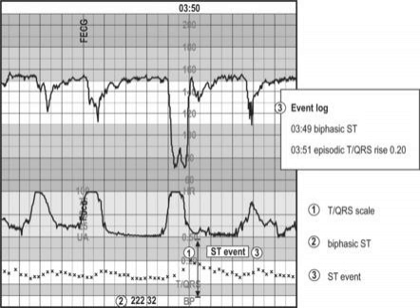They state indications for use of scalp clip were preeclampsia, growth restriction, diabetes, TOLAC, meconium stained fluid, epidural analgesia, augmentation, or abnormal fetal heart rate pattern. Now, as you can see, that is a very diverse group of labors. In their protocol, they also utilized fetal scalp pH when tracings or ST segments became concerning. So they are not only combining traditional fetal heart rate monitoring with the new ST waveform analysis, but also still using scalp pH, which means that they are now using 3 different techniques to monitor the fetus.